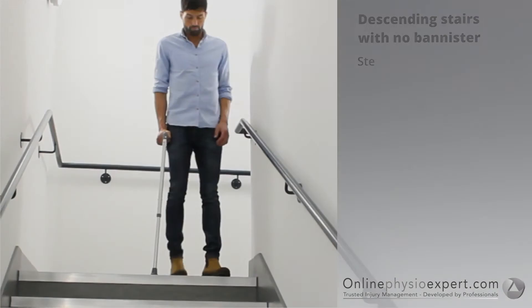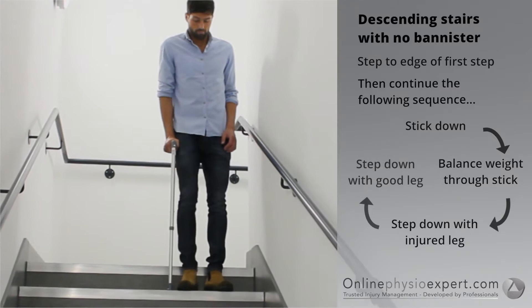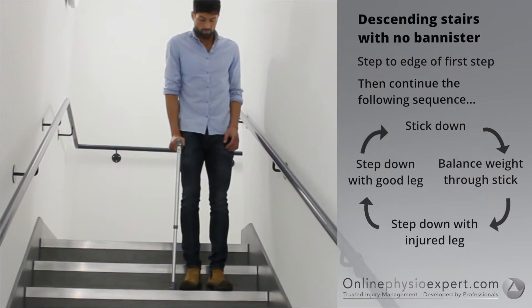To descend stairs with no banister, step your feet to the edge of the first step. Place the stick down to the next step. Find your balance point through the stick and step your injured leg down, followed by your non-injured leg. Repeat these sequence of movements until you safely reach the landing.